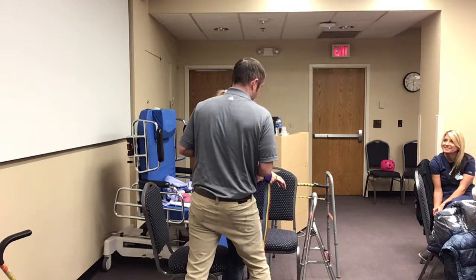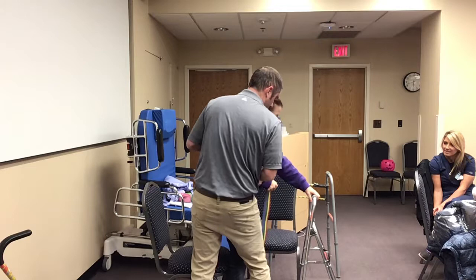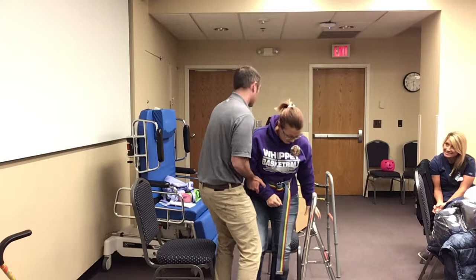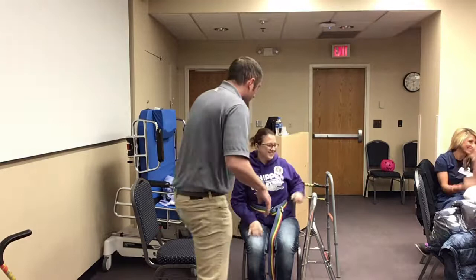We're just going to stand here for a second. Now I want her to put her hand on the hemi walker, with her right leg blocked. We're going to do just a little shimmy over here. Moving along — we're in front of the chair. Reach for the arm of that chair and set your bottom straight back in it. Way to go — she made it.